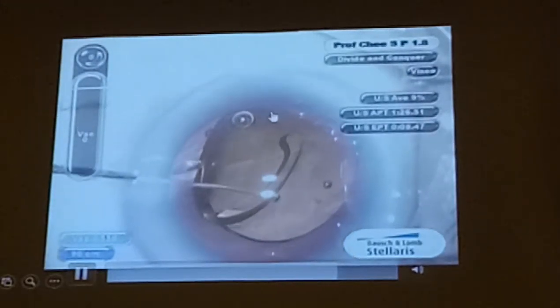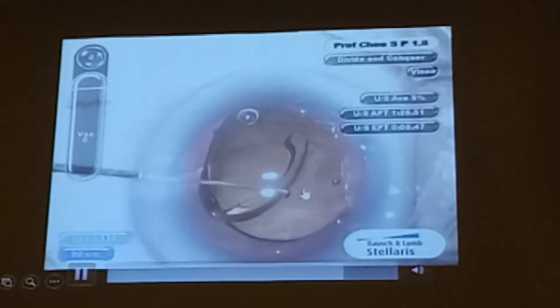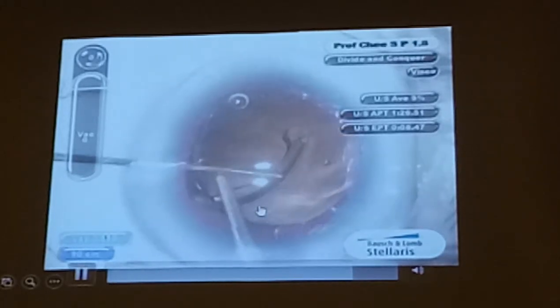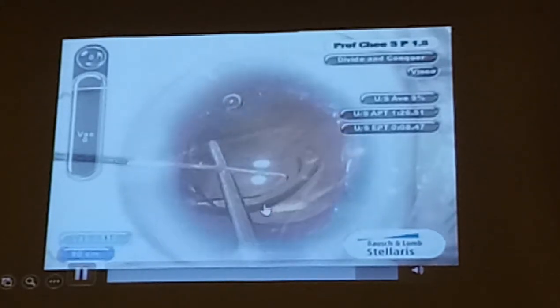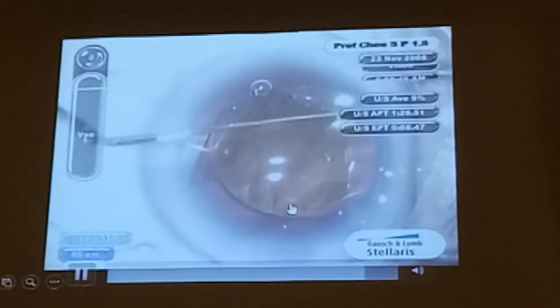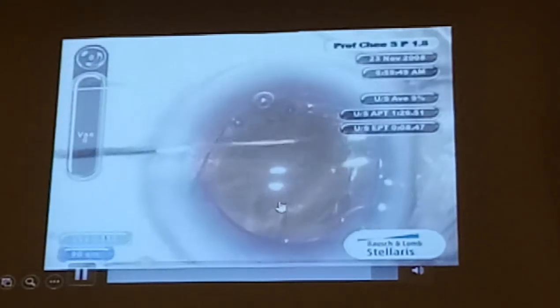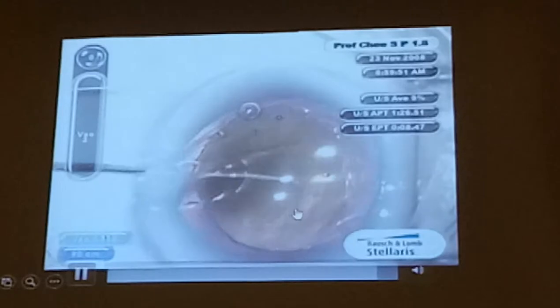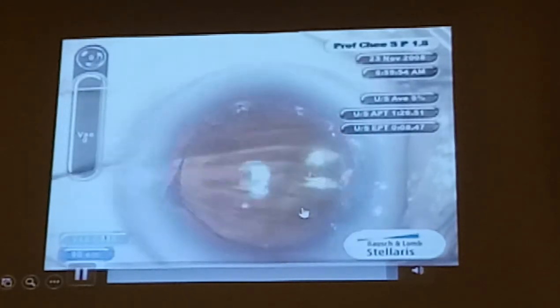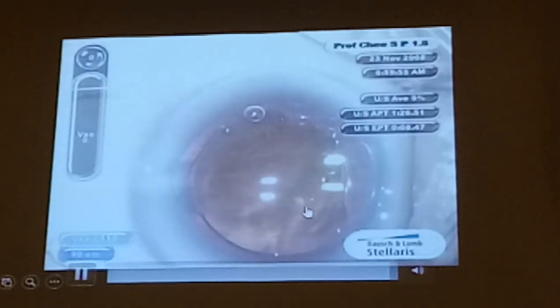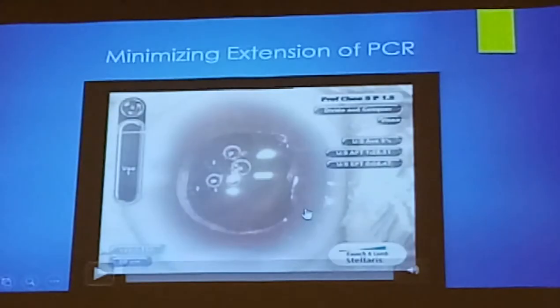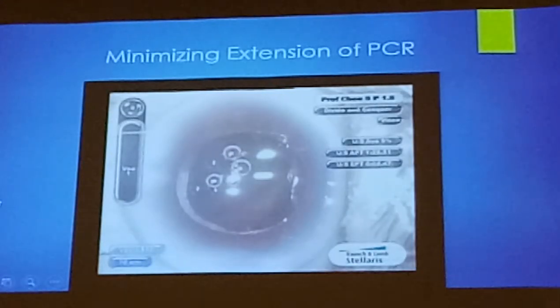Even if it goes quite far out and you can still see it, it's still worth rounding it off because when you place your IOL, you don't have to worry about extension of this — you can still place your lens into the capsular bag. You can see this lens unfolds very slowly, gently, and you can still have time to maneuver it into the bag. I was telling some of the doctors that you don't always have to dial a lens in — you can place it in. The important thing is that if you get your optic into the posterior position, you let go and have it drop into the bag. You don't have to dial it in.